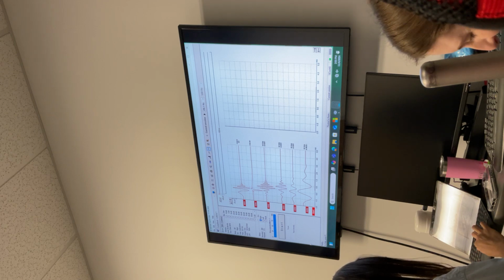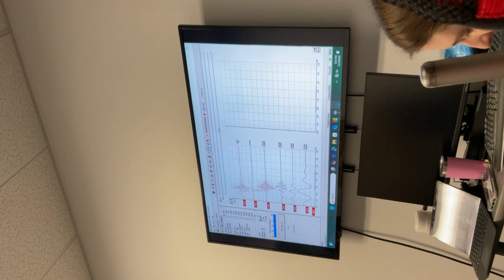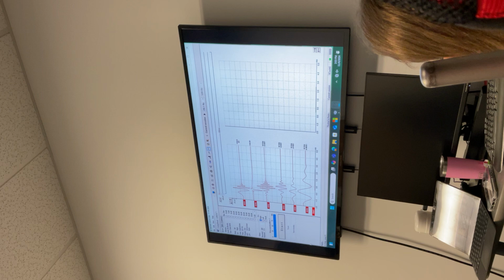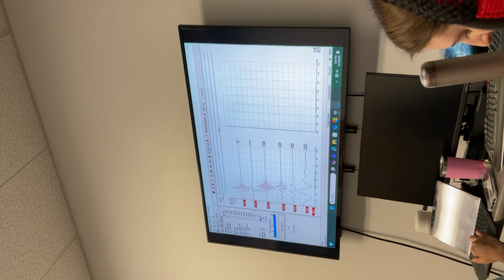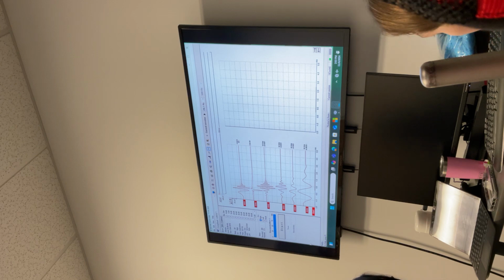So this is the stimulus that you're playing, and that is resulting in the ABR response. And another important thing with the chirp is 0 is not the onset of the sound. The sound onset is going on sometime before. It's all shifted so that the wave 5 latency is similar to that of click across all intensities. I think you all agree that it's a positive thing, so that you don't have to adjust the time window. Okay, we'll place electrodes and get started.